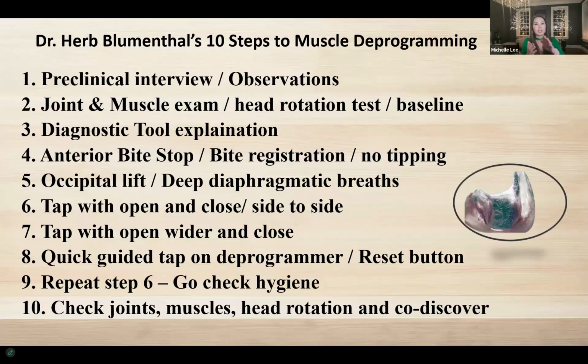and I just have the patient tap, tap. I also do a really nice diaphragmatic breath and just make sure the patient is really relaxed, so the muscles really have a chance to relax as well. And I have the patient tap, tap, tap, open and close, and go side to side. And this is something that I learned from the TMD courses and from Dr. Herb Blumenthal. It's this quick guided tap on the deprogrammer, and I call it the reset button.